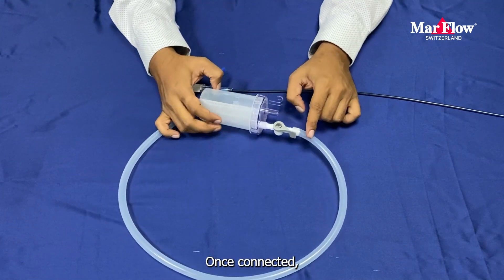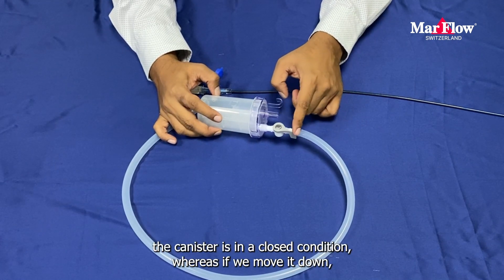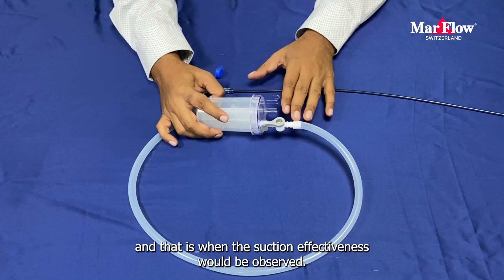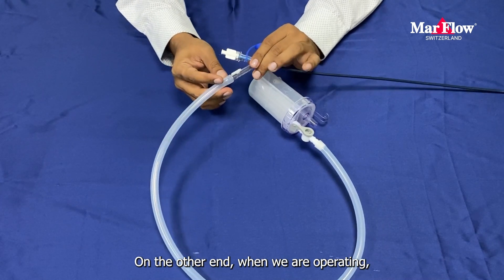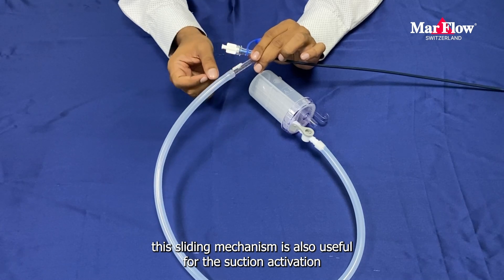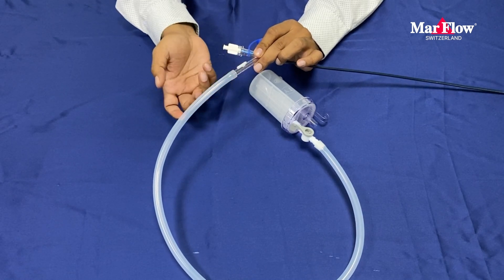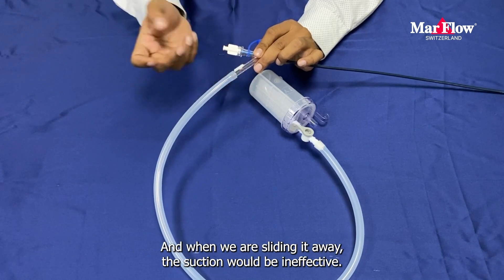Once connected, this lever — when it is upwards — keeps the canister in a closed condition, whereas if we move it down, that is when the suction effectiveness would be observed. On the other end, when we are operating, this sliding mechanism is also useful for suction activation. When it is completely closing the outlet, the suction would be active, and when we are sliding it away, the suction would be ineffective.